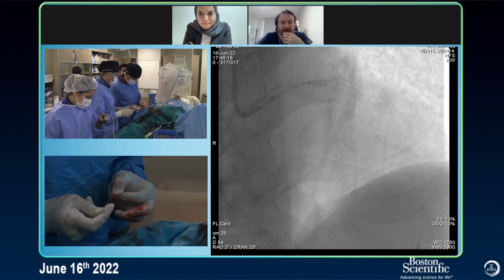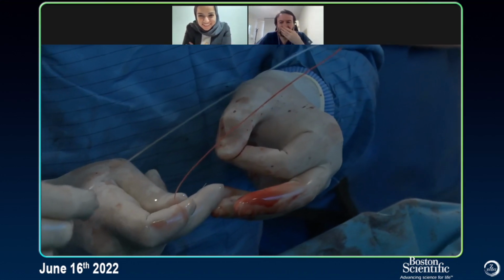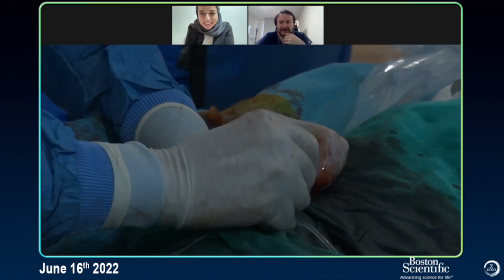Russia, only the two of us left? Still around. No more excitement. No trapped stents. It's enough. He's making it look easy now.